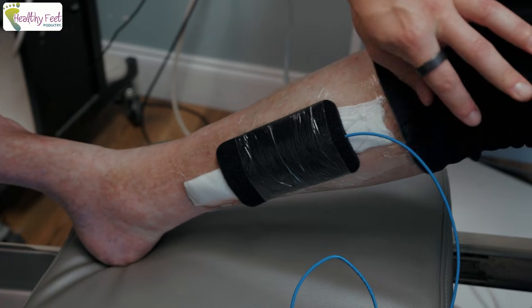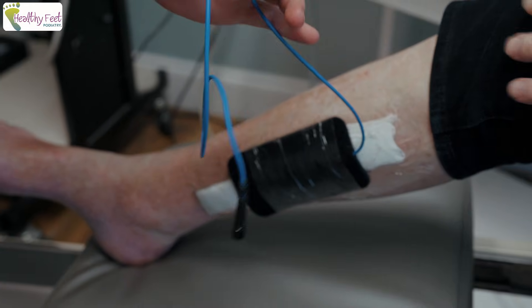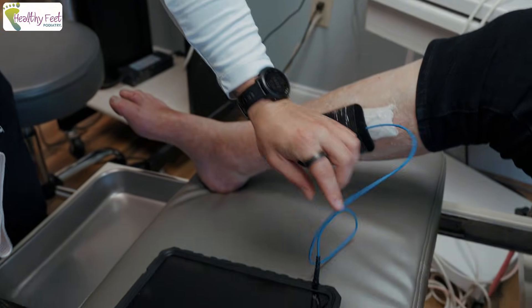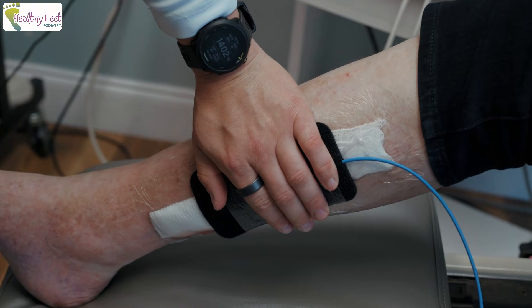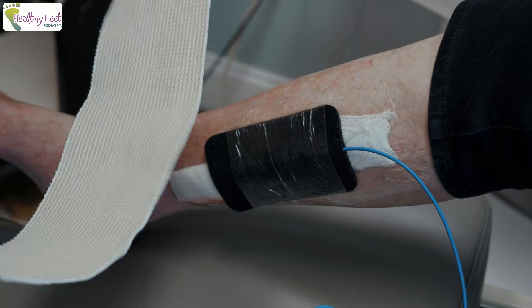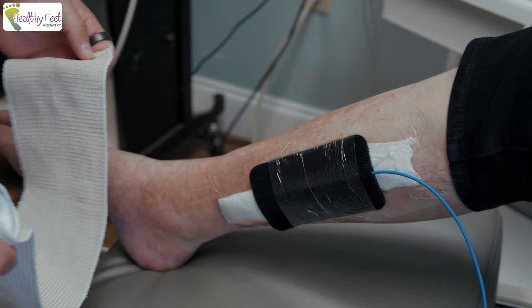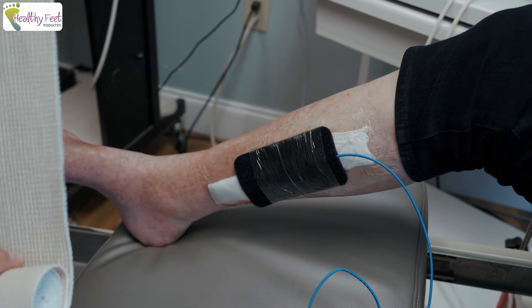Once the procedure was done, we put our pad on here. This pad connects to our battery — the power source. Once we turn that on, the pad transfers the energy to the lead in order to stimulate that nerve. The patient will wear this for about five to seven days to really see if this device gets rid of his chronic pain.